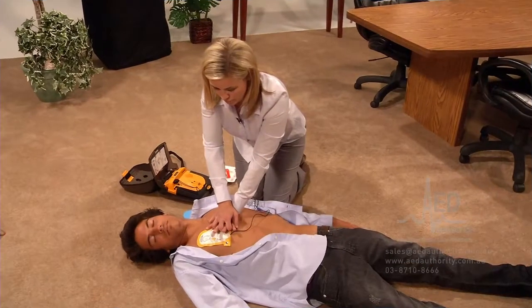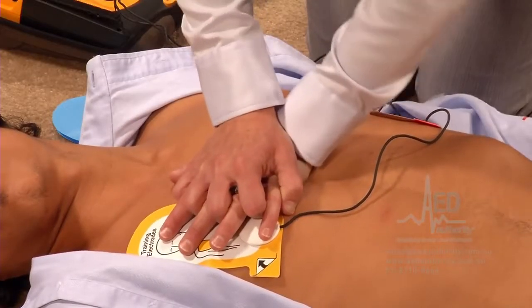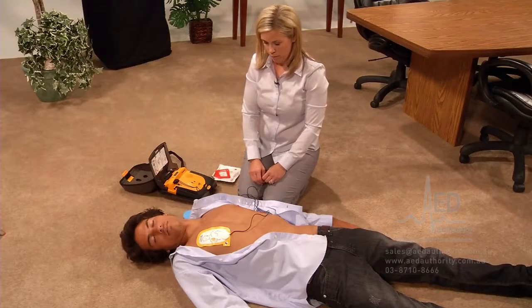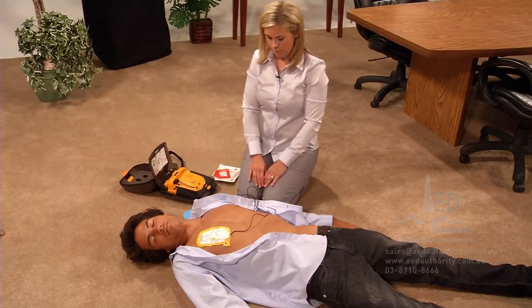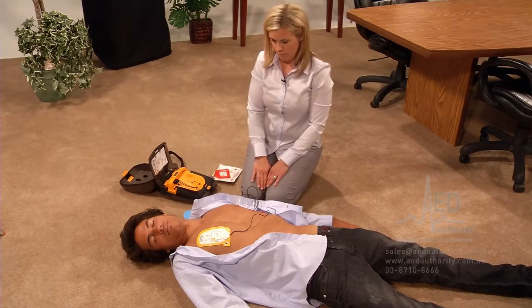While you perform CPR, the AED will interrupt you at regular intervals so it can check if another shock is necessary. Do not touch the patient while it says: "Evaluating heart rhythm." Keep standing clear of the patient while the AED is evaluating.